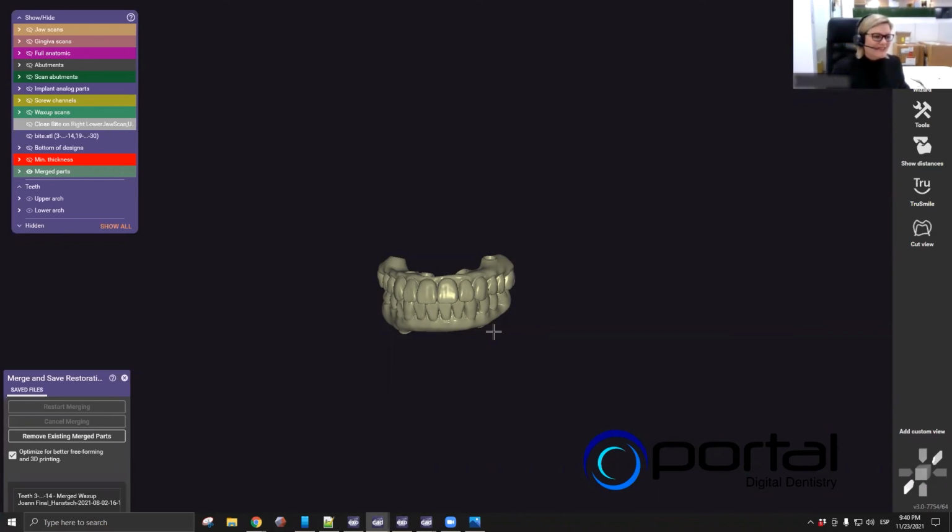So I'm sure we'll look into the possibility of setting up a session dedicated to these types of restorations, especially since you said they are really popular, and you have done a lot of them. I can easily see a great opportunity here. As you say, you can have these immediates on the printer before the patient even wakes up from surgery.